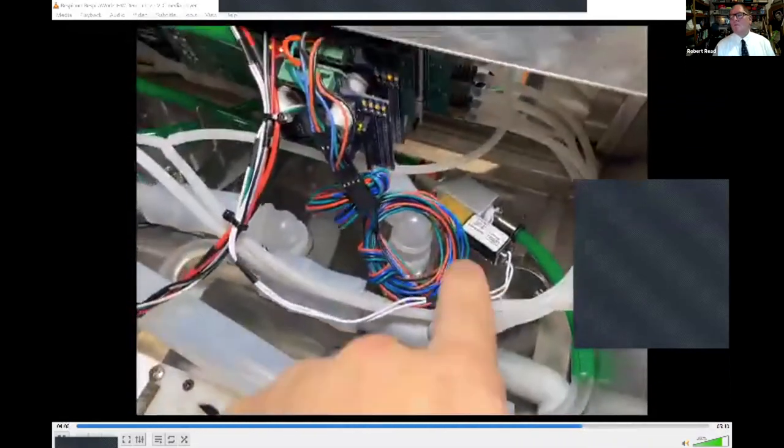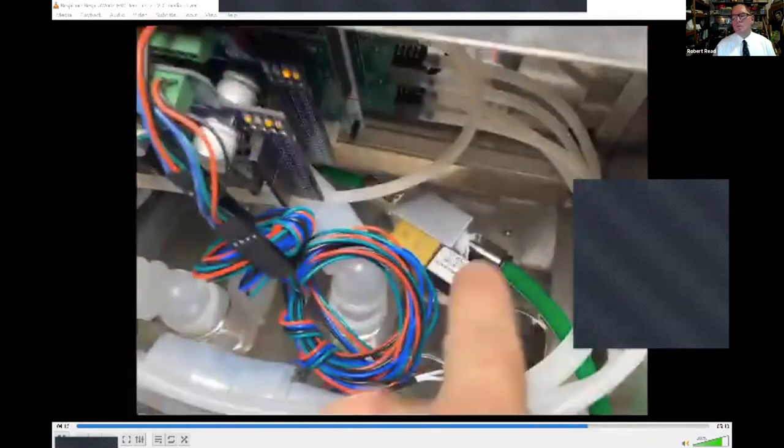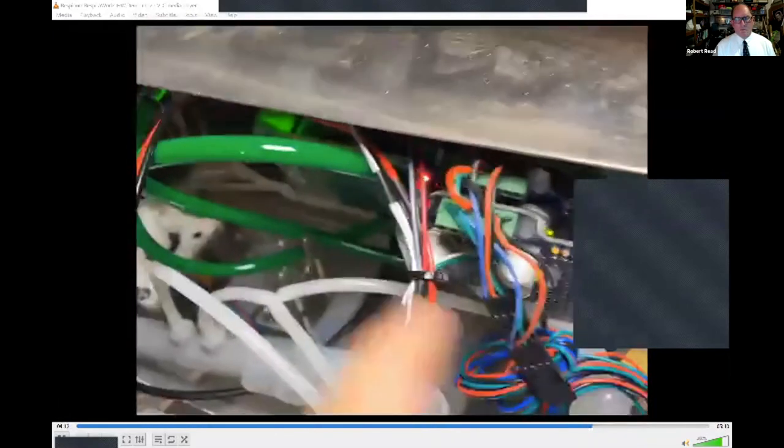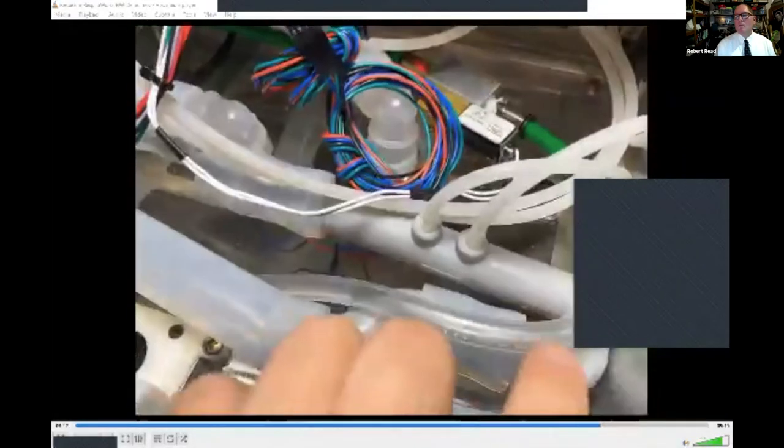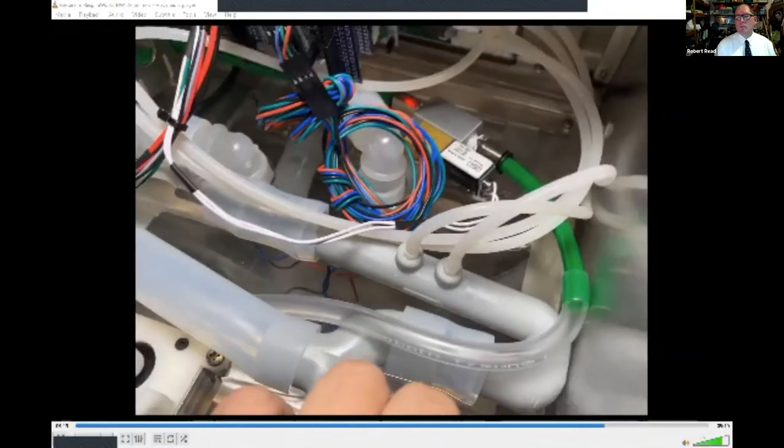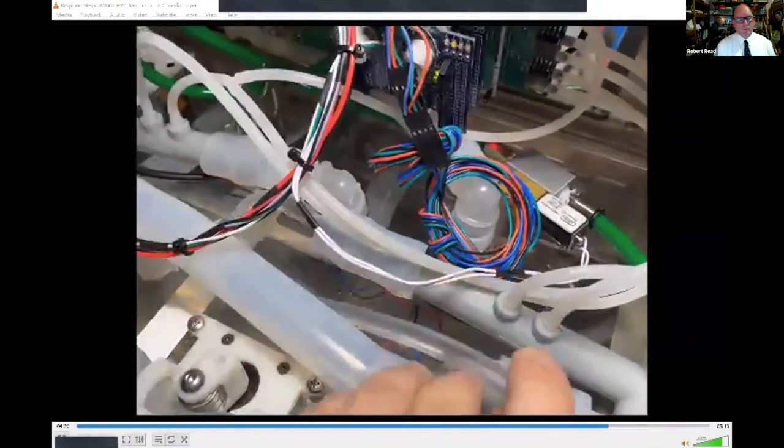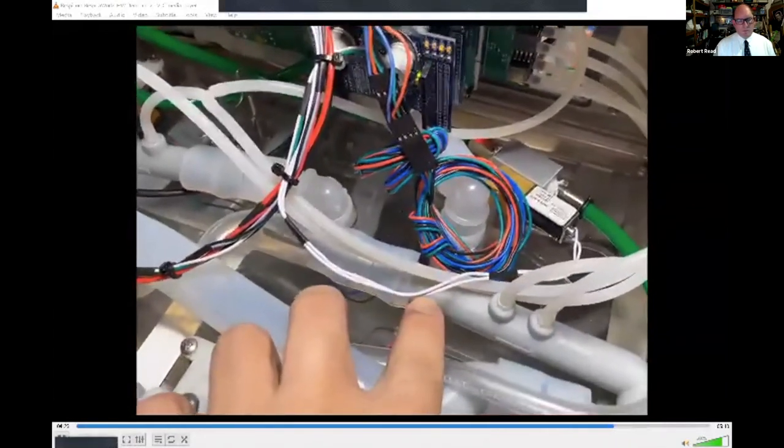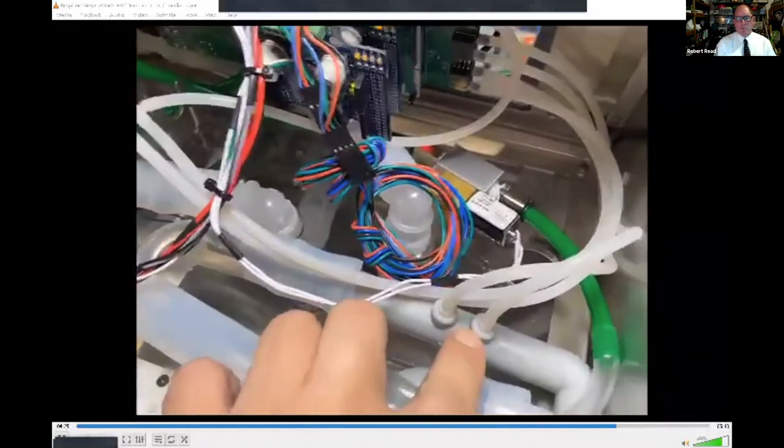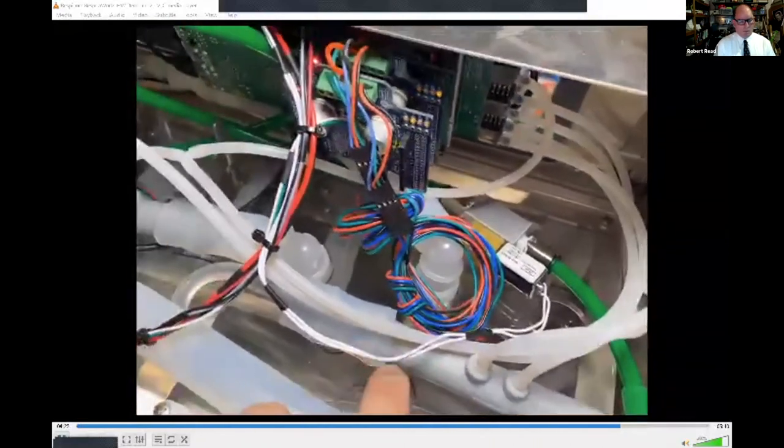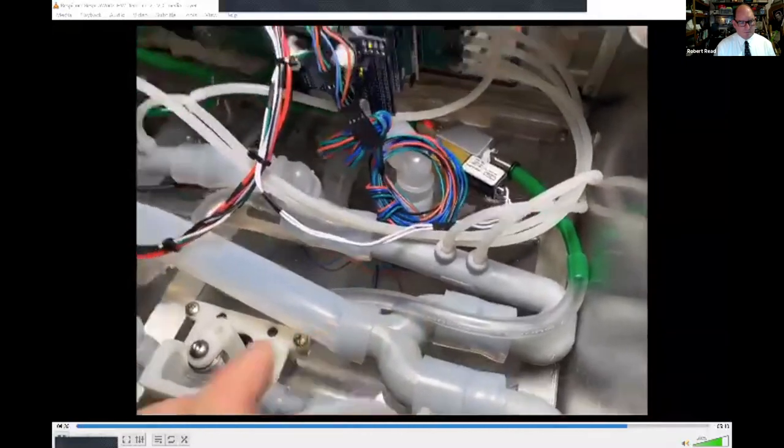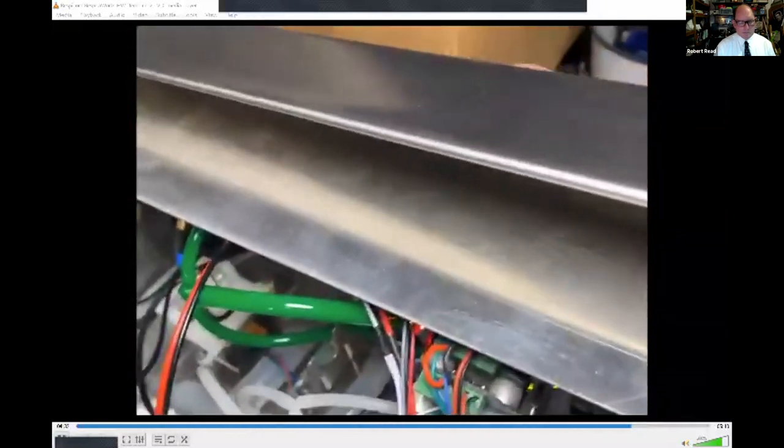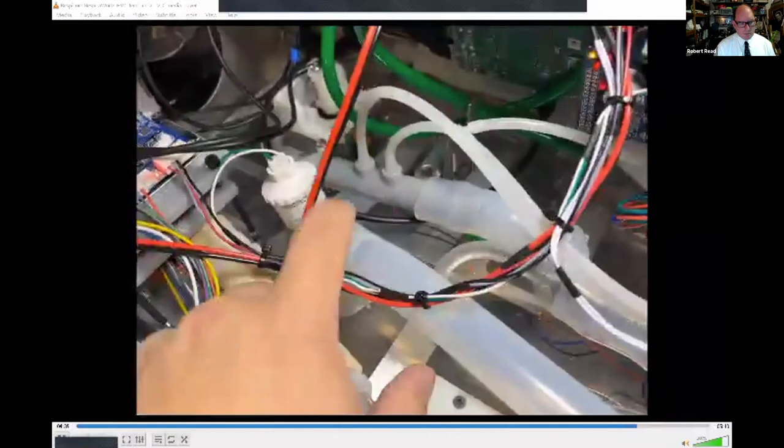In the oxygen path, we have oxygen entering here, coming through our proportional solenoid, which is also controlled by our circuit board. And it then enters through its own, through this hose here, through its own Venturi pathway. So we measure oxygen flow here, and then that enters and combines through this Y out to the patient outlet.